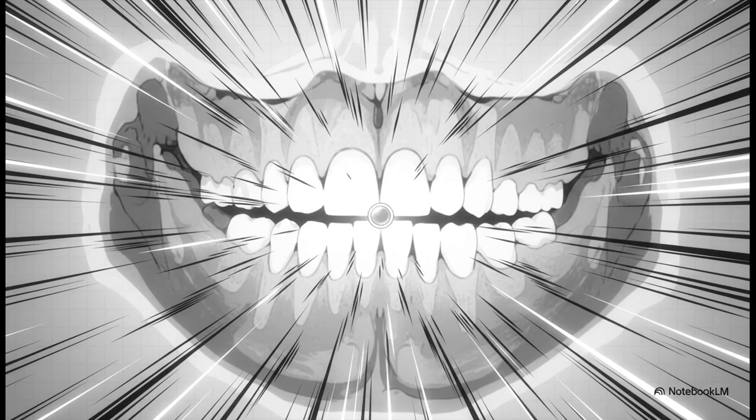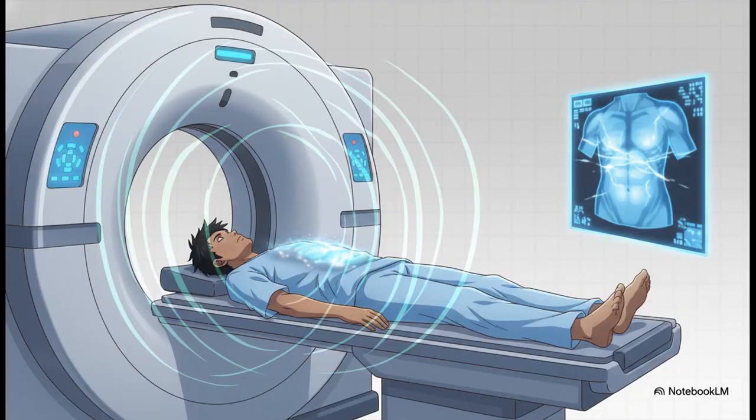Metal is just so dense that it causes this perfect storm of extreme beam hardening and photon starvation. The result? These crazy starburst-like streaks that can completely wipe out any useful information in the area. And finally, sometimes the cause is, well, the patient.